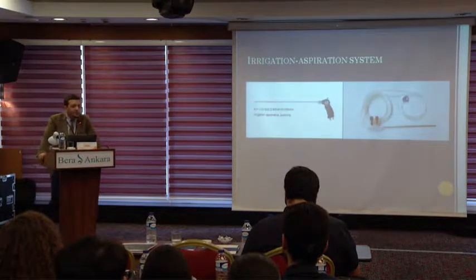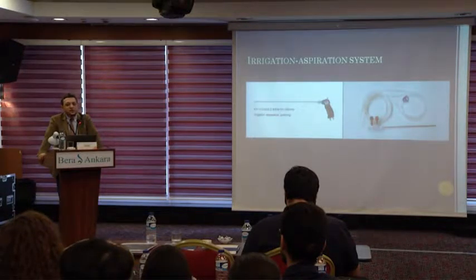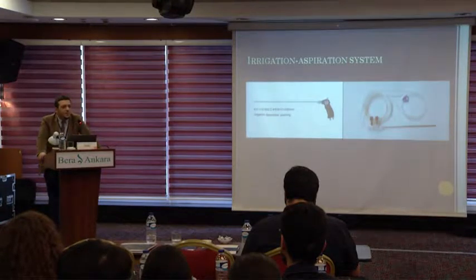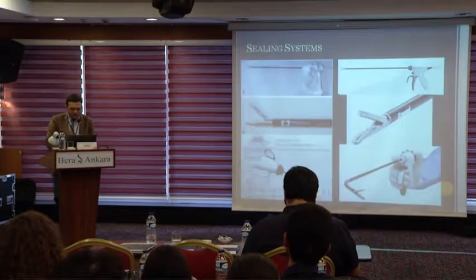For most laparoscopic surgeons, this tool is more than irrigation and aspiration. It's also used for dissection of the tissues with the principle of traction and counter traction. So for this apparatus, it's recommended to use an ovally shaped, blunt tip to avoid complications.